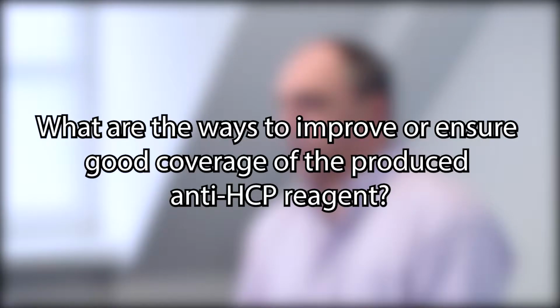What are the ways to improve or ensure good coverage of the produced anti-HCP reagent? So generating anti-host cell protein reagents can be a challenging process. There are certain protein species within the sample that are poorly immunogenic or at low abundance and oftentimes do not give a good immune response when analyzing by Western blot. And so there are a couple of different ways to approach resolving that problem.